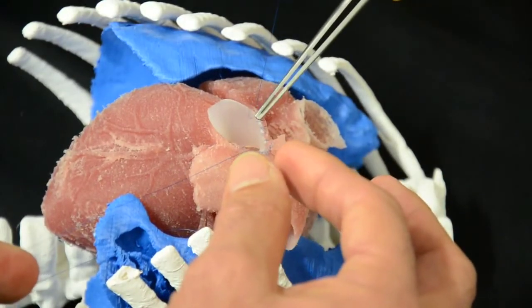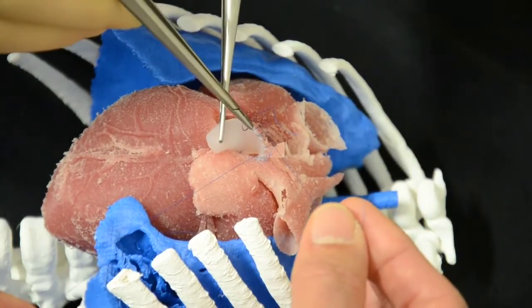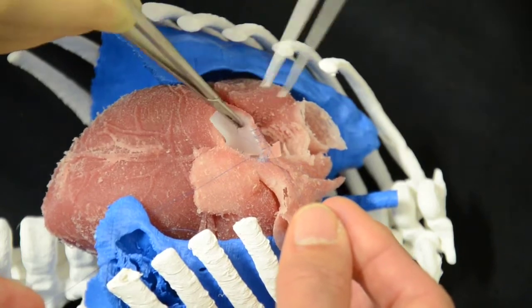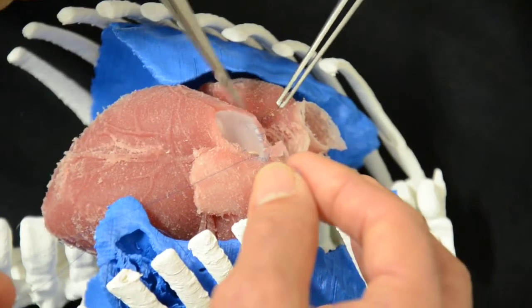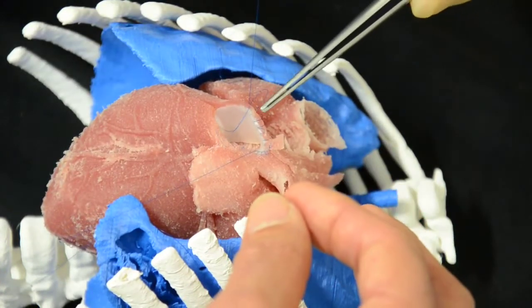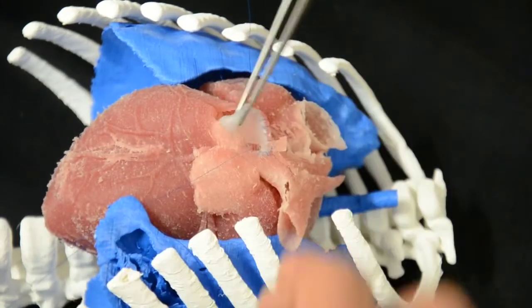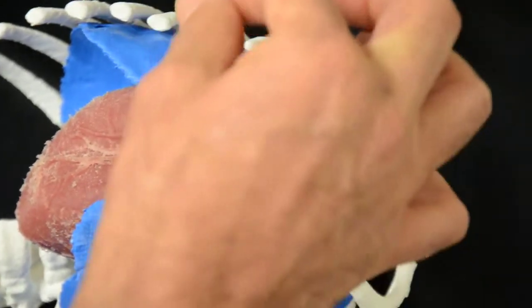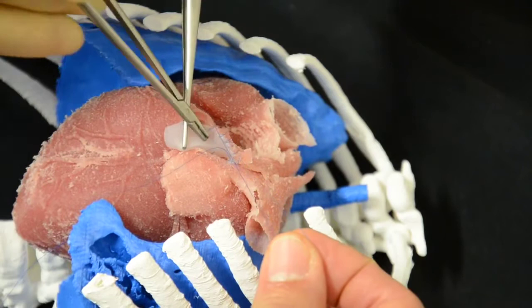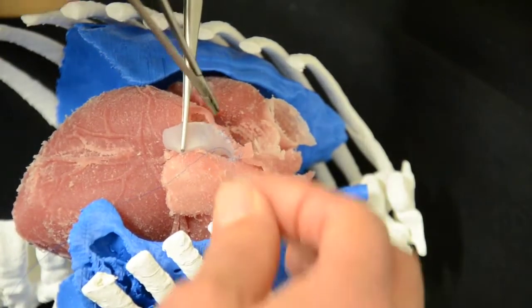It's a good feeling, yeah? The silicone is very soft. Because one of the issues with simulations and surgeries is that you can simulate the defects — meaning the holes — but the actual feeling when you do the operation is incredibly important. In this particular case, it's probably one of the best materials that we have tried.